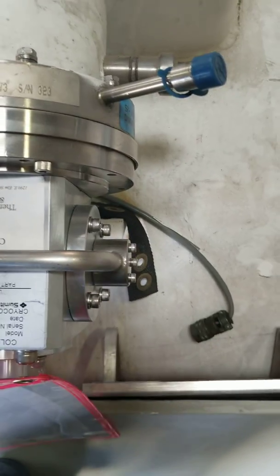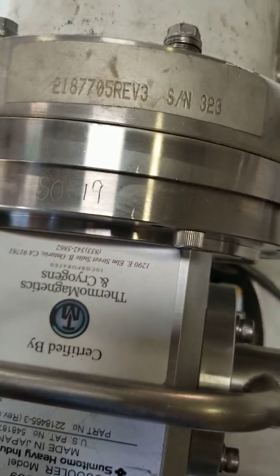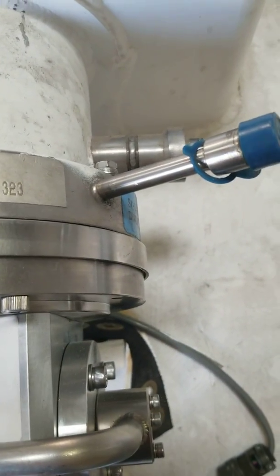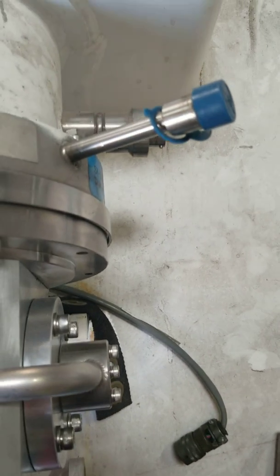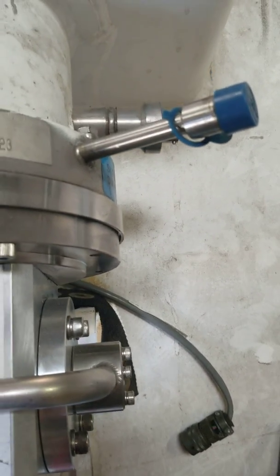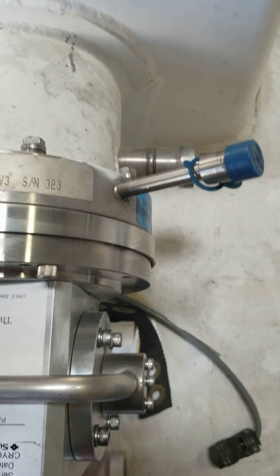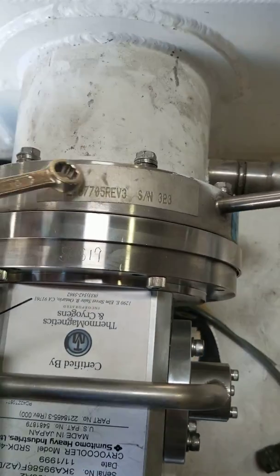It's also smart to listen to the cold head. Get your ear up close to it and listen to it. If you hear any not really loud grinding or crunching sounds, you might have contamination inside the cold head that's frozen and crunching. If you hear it knock really loud, sometimes that's an indicator that the cold head is near the end of its life. And that's it. Thank you.